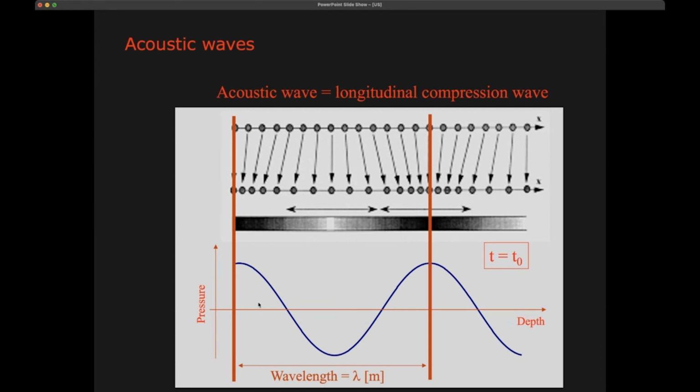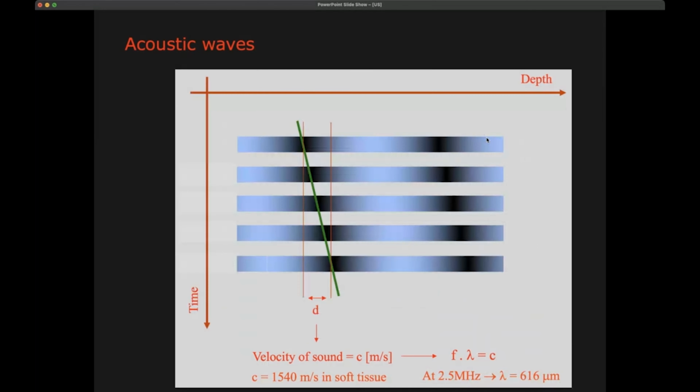Obviously, since it is going on with a certain frequency, it has a certain wavelength in time and a certain wavelength in space. These are the things that are important and will determine some of the properties of the ultrasound. So as we said before, you can look at it as a displacement of the particle in space and, of course, a displacement in time. So we see already that there are these two components, space and time, which are important, and that then becomes wave propagation.